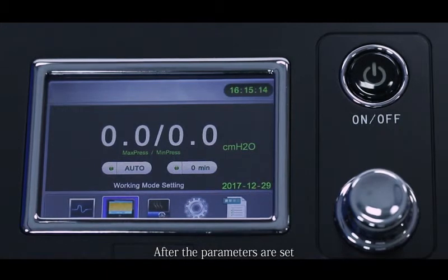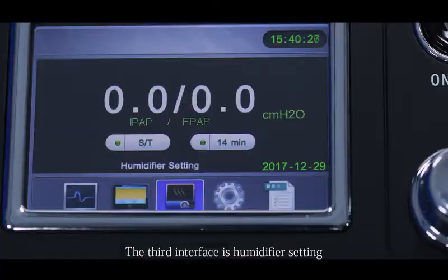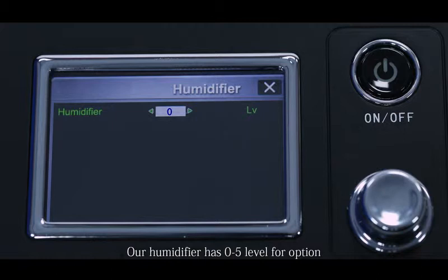After the parameters are set, press the on/off button and the device will start running. The third interface is humidifier setting. The humidifier has 0 to 5 levels: Level 0 is off; Level 1 is 45°C; Level 2 is 50°C; Level 3 is 55°C; Level 4 is 60°C; Level 5 is 65°C. The higher the level, the higher the temperature.